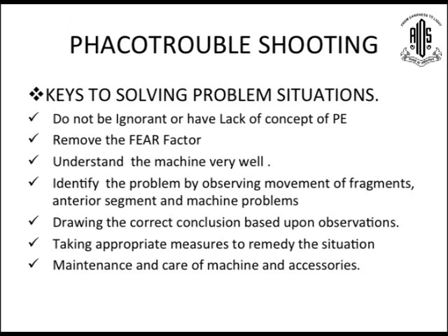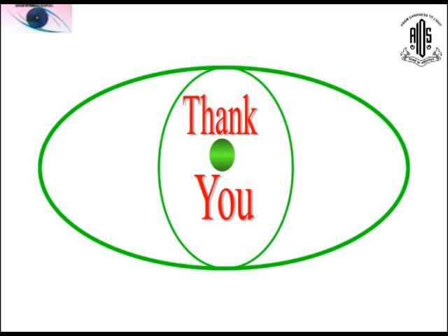Keys to solving problem situations are: do not be ignorant or lack the concept of phacoemulsification. Remove the fear factor. Understand the machine very well. Identify the problem by observing movements of fragments, the anterior segment and machine problems. Draw the correct conclusion based upon the observation. Take appropriate measures to remedy the situation. Maintenance and care of machine and accessories. Thank you for your kind attention.